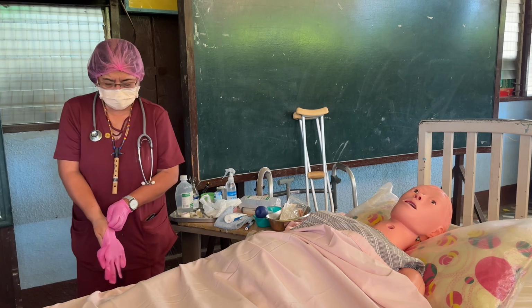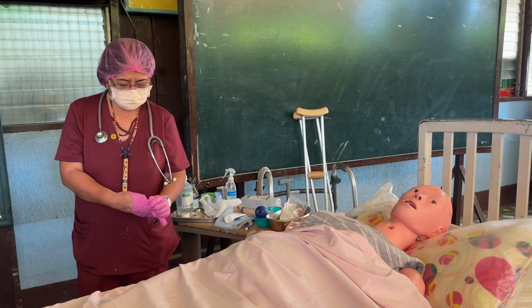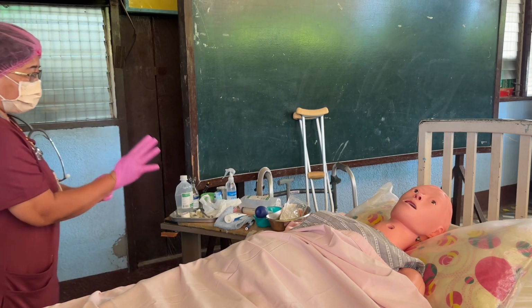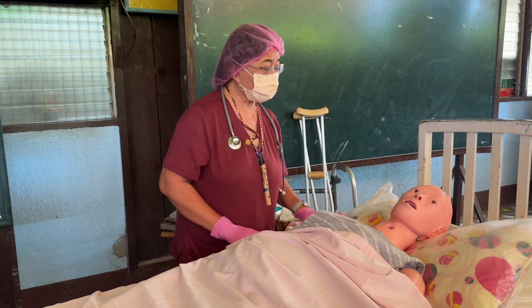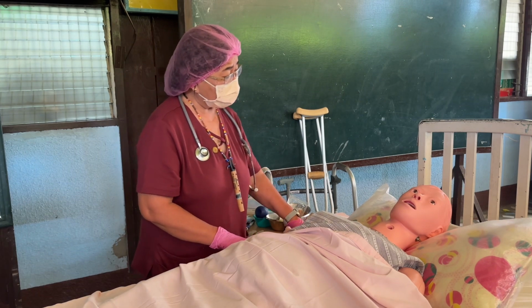After wearing the clean gloves, you knock on the door of the patient's room for courtesy. Knock, knock. Hi, ma'am. Good afternoon. I'm Mari Art Dulu, your caregiver for today, from 3 p.m. to 11 p.m. May I know your name, ma'am?